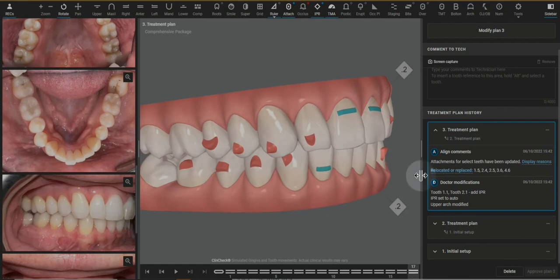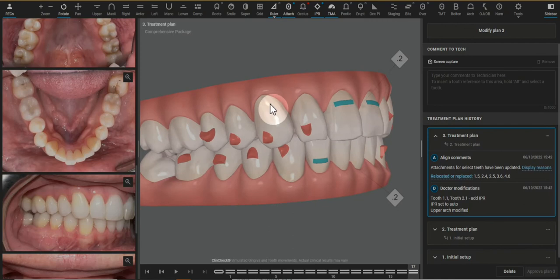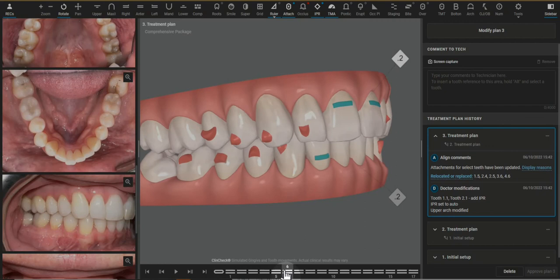It's also counterproductive to the case. So we can write to the technicians and ask to eliminate mesiodistal root torque, or I can change that with the 3D controls. If we see that this starts off with a black triangle but then doesn't finish with a black triangle, then I'm looking at the laterals and seeing what's happening here.